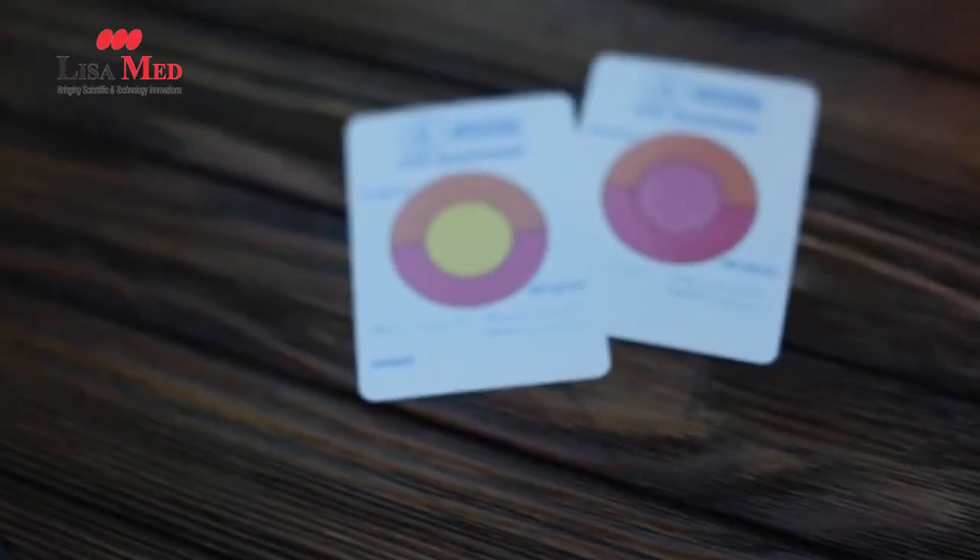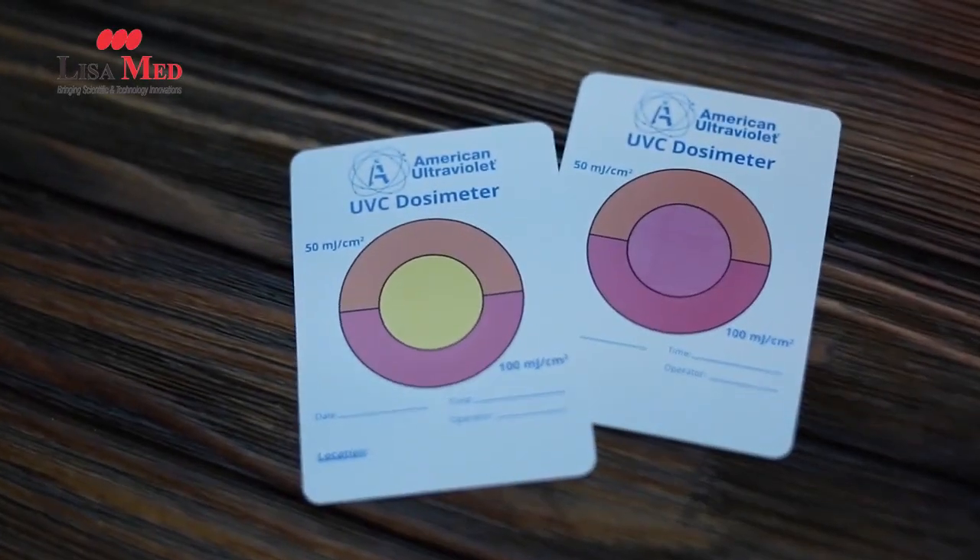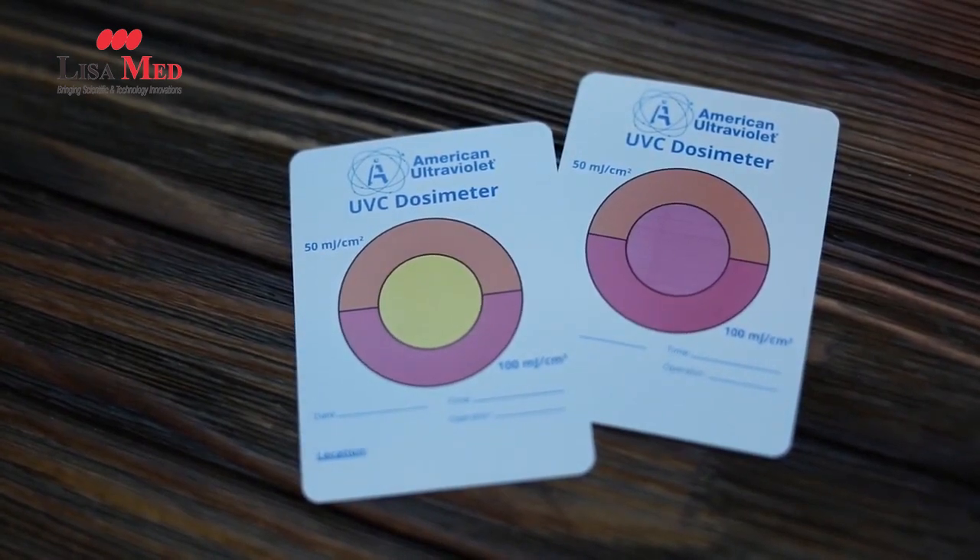The last card here has a pink center, and this shows us that this card has received enough ultraviolet to correspond to basically double the dose of the orange section, which is 100 millijoules per square centimeter.